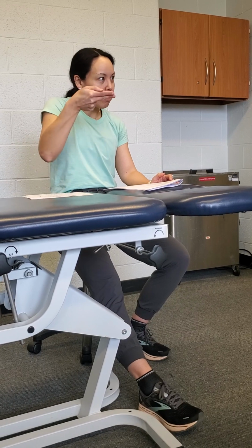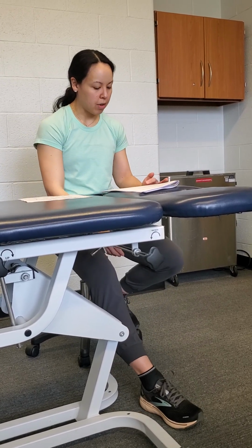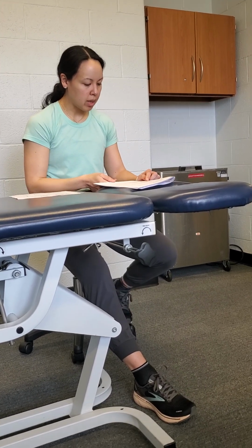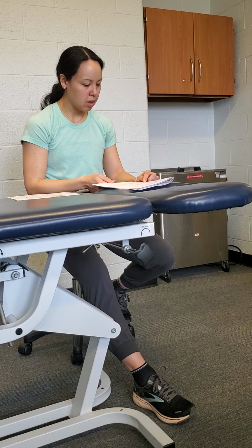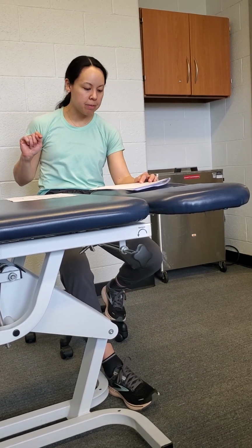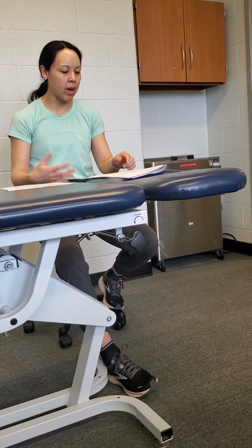Two-finger test, right? You shouldn't really be able to get one finger underneath the cuff, between the cuff and the limb. And then once you get the cuff on, you hit the blue PTP button, and then it's either going to accept or reject. So accept means you've got an accurate number, you can start exercising right away.